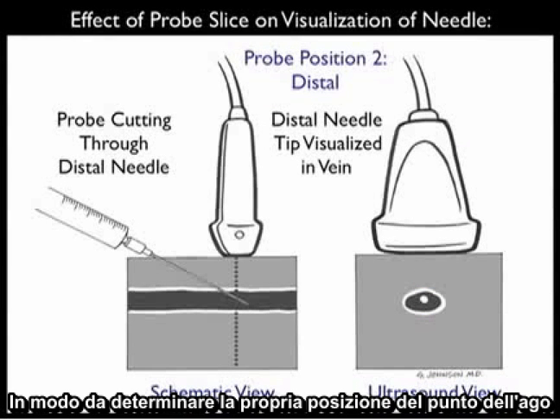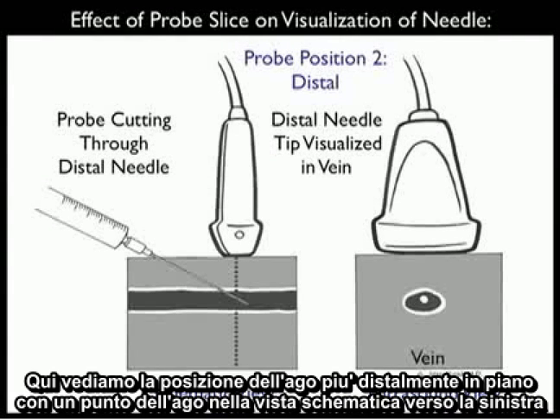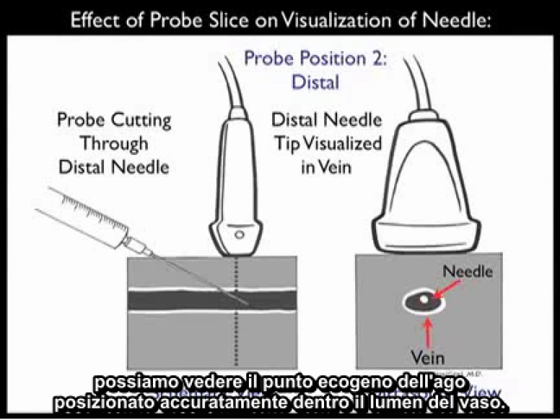In order to accurately determine the location of the needle tip, we need to move the probe more distally as we advance the needle into the patient's neck along the course of the vessel. Here we see the probe positioned more distally, now in plane with the needle tip in the schematic view towards the left, and there we can see we can get an accurate determination of the location of the needle tip with regard to the venous lumen. We see the ultrasound view towards the right, and now we'll be able to see the echogenic tip of the needle accurately positioned within the vessel lumen.